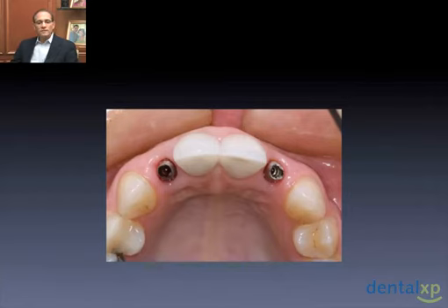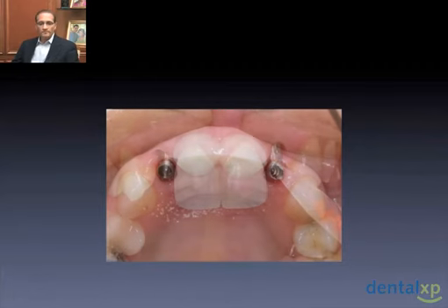And still, we can see the discrepancy between the abutment at this stage and the soft tissue, both from the front and from above, realizing that it does not really support the soft tissue that we have, which is key. And this is where we need to take control and create a provisional that's going to support those soft tissues and create a foundation to build the final restorations from.